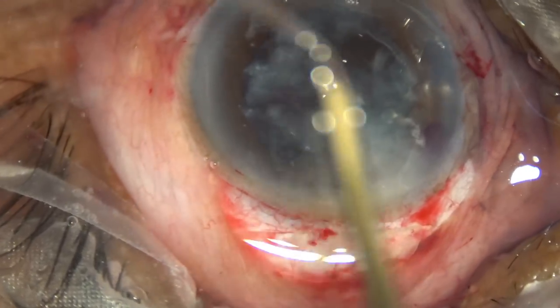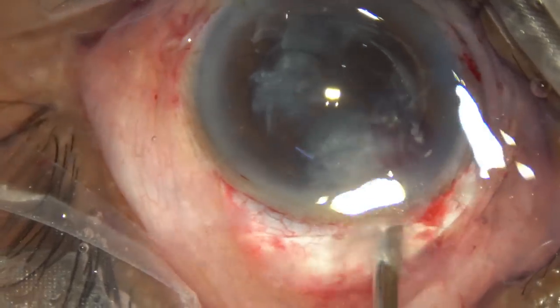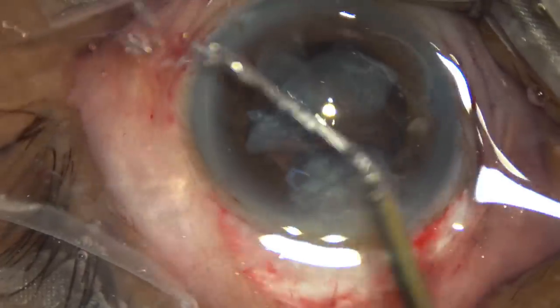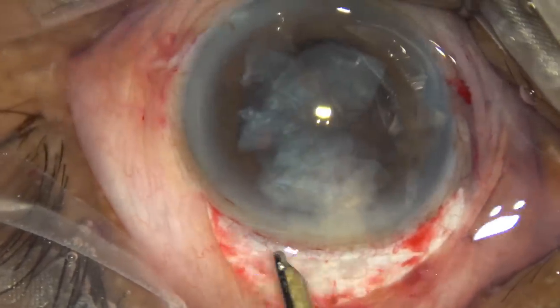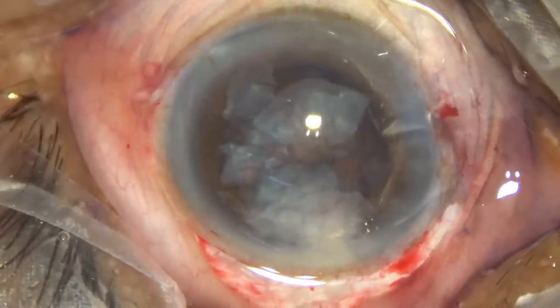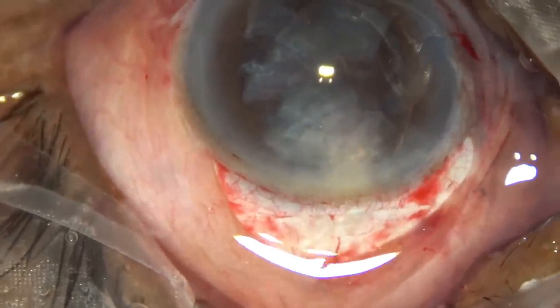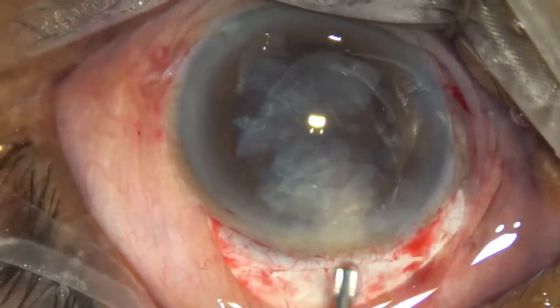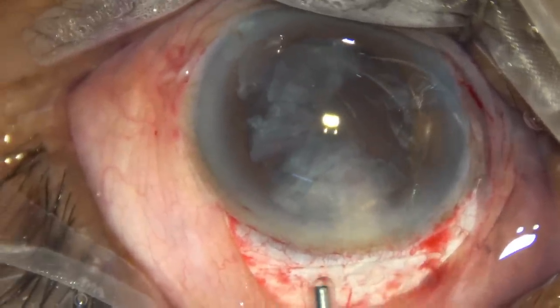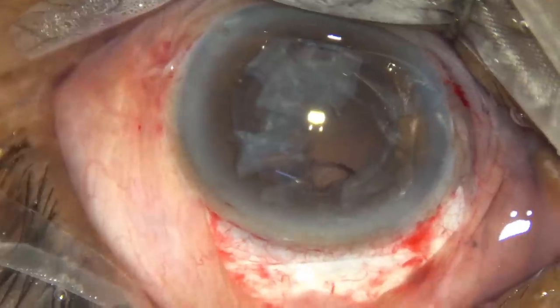Going to flush some BSS in the anterior chamber. There's some chunk of epinucleus, part of nucleus. We're going to express it out with the help of visco. Visco this side, visco on the other side. Now press the posterior lip and it comes out.